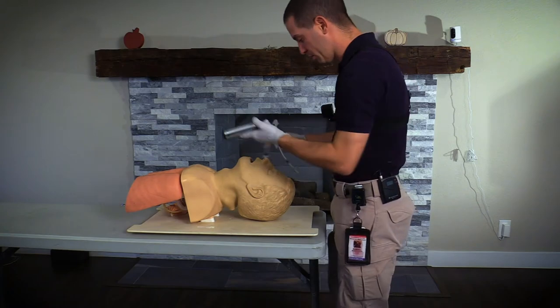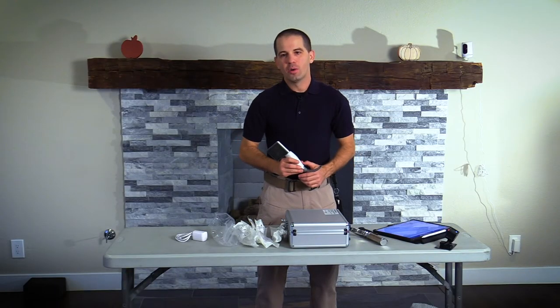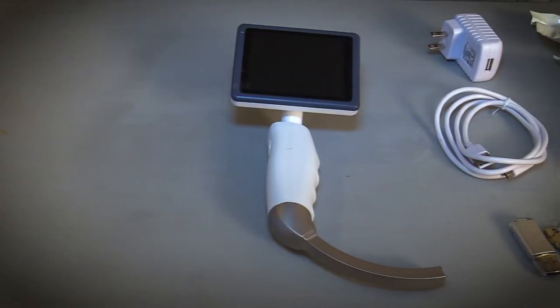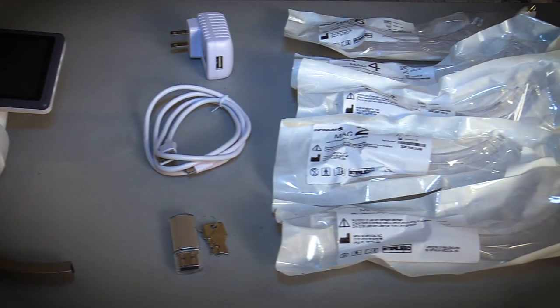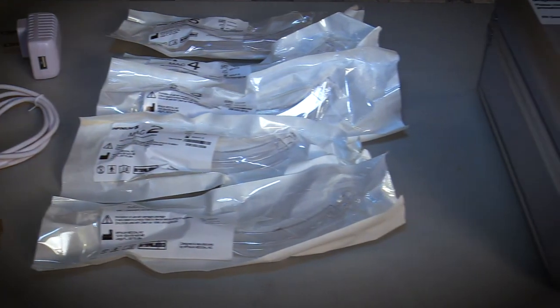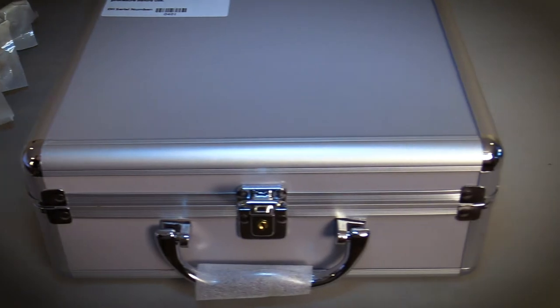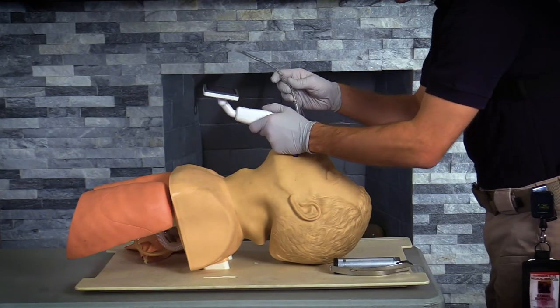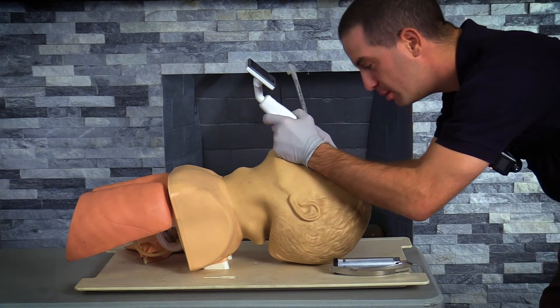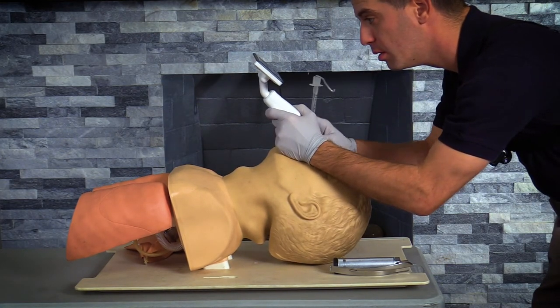The EMS agency I work for has decided to go with the Clearview Video Laryngoscope. First of all, it's very comparable to other video laryngoscopes such as the McGrath or the C-Mac at a much lower price point. Secondly, the Clearview uses similar movements compared to a manual laryngoscope, so it feels much more natural to those of us who have been intubating for a long time.